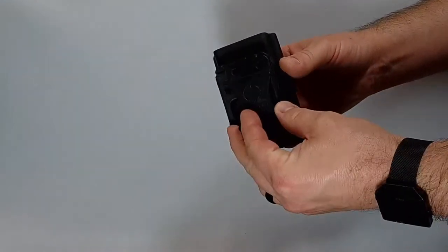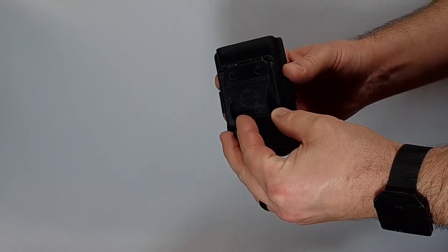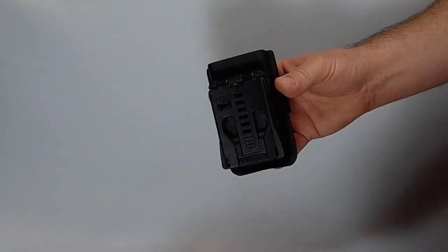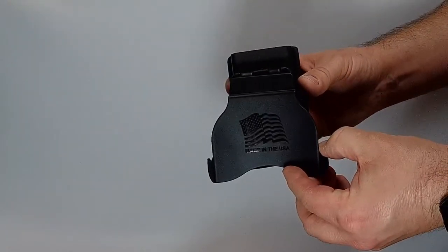We can do a fold over clip 1.5 inch or 1.75 inch, or we can also use a paddle to mount on this.